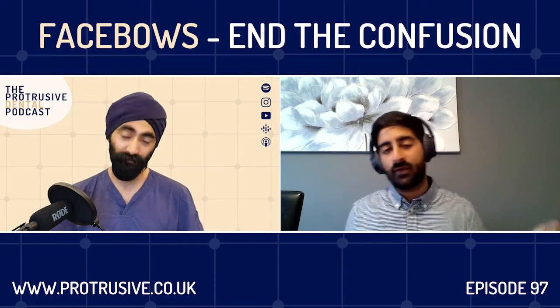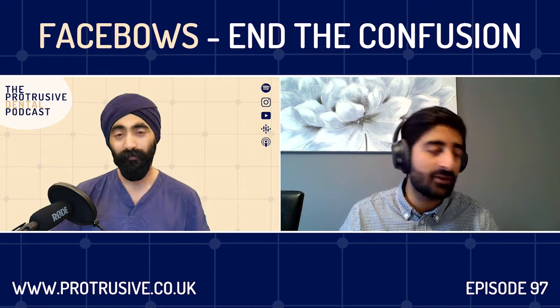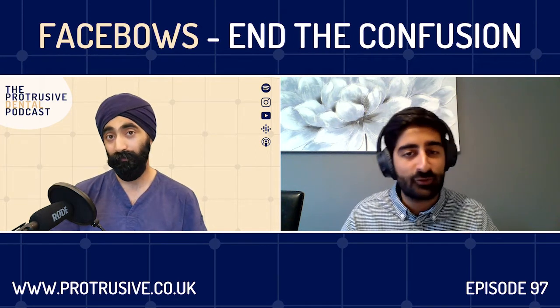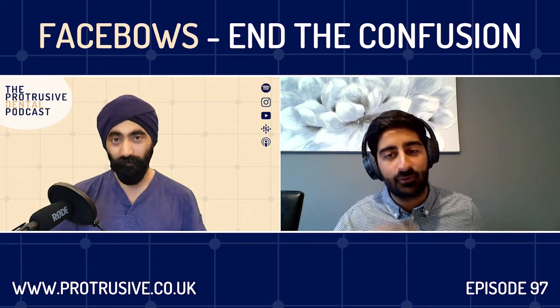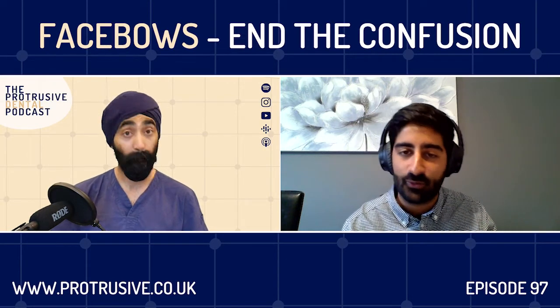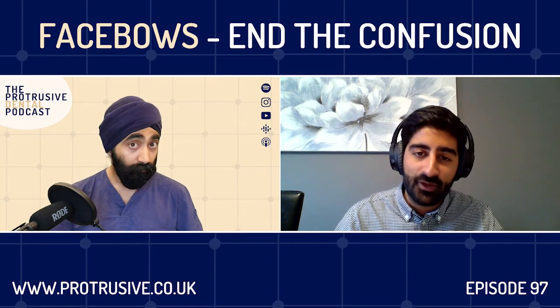And I see a lot of these, like even I post them, we do a lot of zirconia crowns nowadays, monolithic zirconia crowns, which work amazingly well. But as we're going to these kinds of materials, they're more and more difficult to adjust in the mouth. And for me, the degree of precision you need is only going up and up and up. And so using things like Facebows and proper wax-ups, the first principles should always still be there in all of our minds. And the other thing to note with the Facebows, there's no harm in doing it whatsoever.